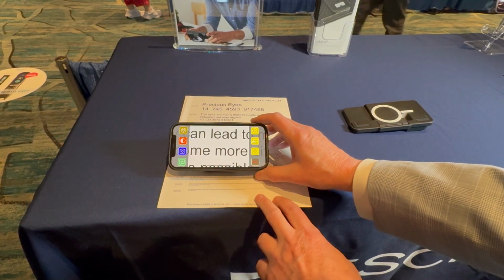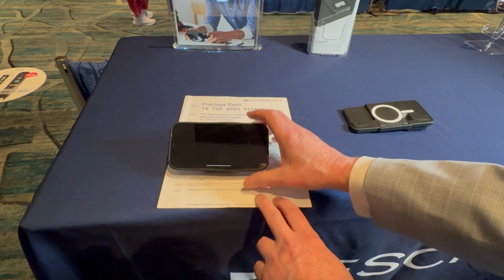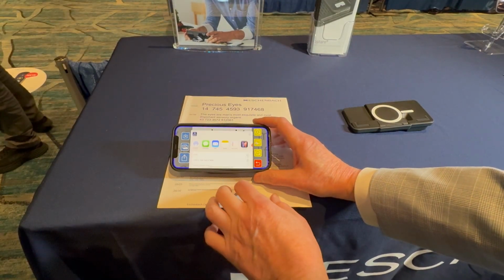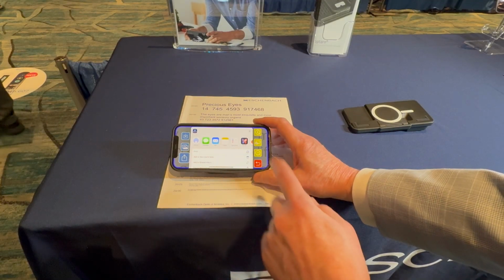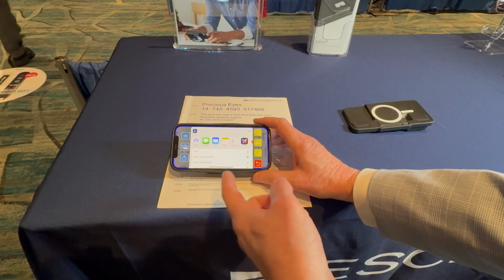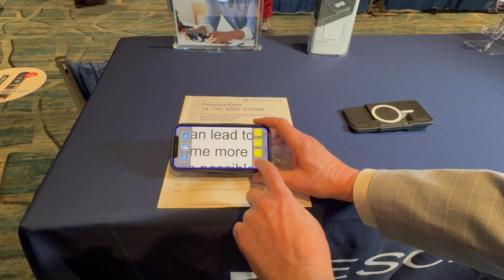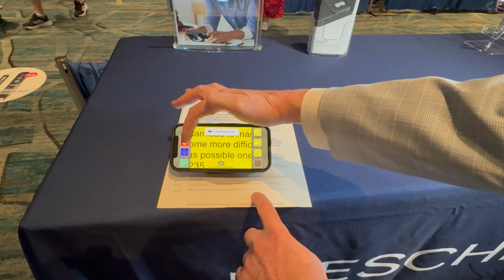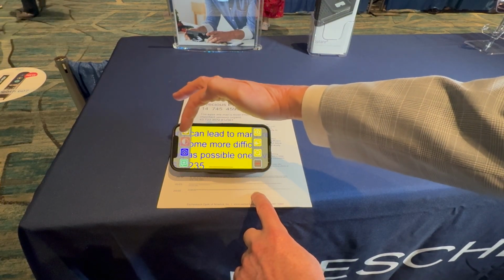Above that is the camera button, and of course you can take a freeze frame, and because it's integrated with your iPhone, it's very easy. You can actually now just email it or text it or AirDrop it. You don't need to worry about downloading it to another device. Above that is the contrast button, so you can scroll through different color combinations, and above that is the settings.